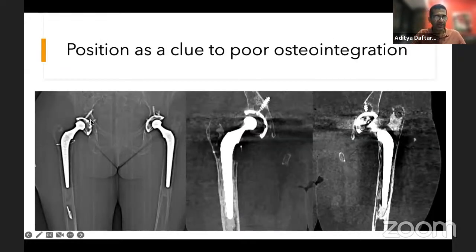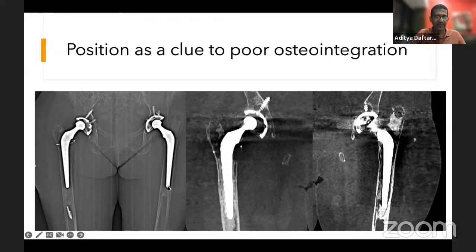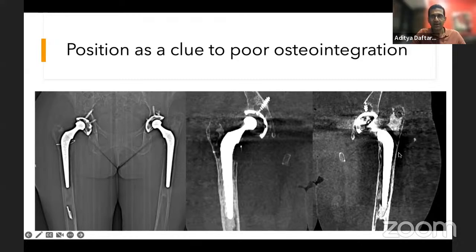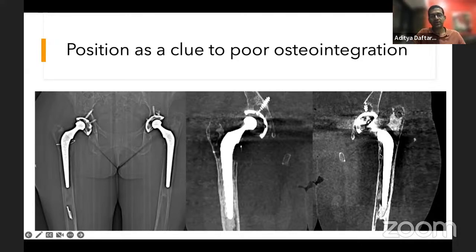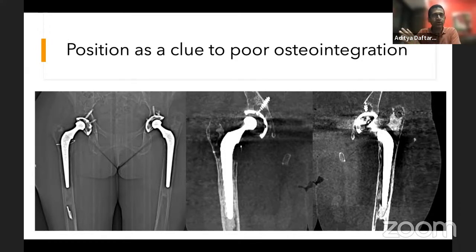Here's a more gross case with liner wear. The femoral stem on one side is appropriately located within the shaft center, but on the opposite side it's abutting the lateral cortex. On CT, one side shows a nice prosthesis-cement interface and cement-bone interface, while the other side shows a clear lucency along the cement-prosthesis interface with angulation indicating cement fracture — this entire prosthesis is loose. Anytime you see abnormal positions, look for sclerosis (stress-related) or lucencies (osteolysis or failure-related).